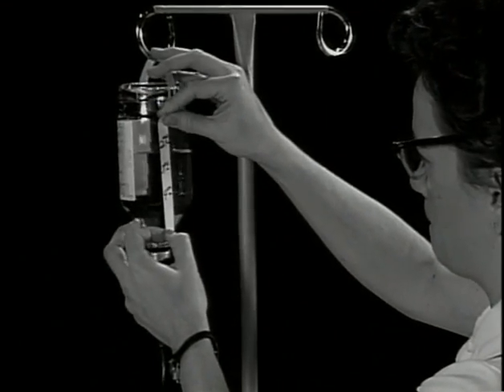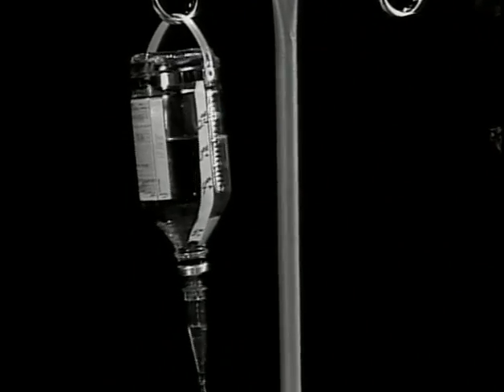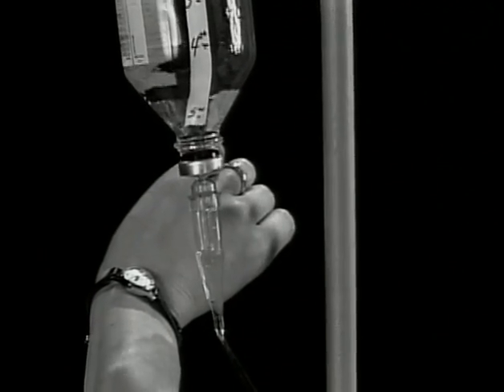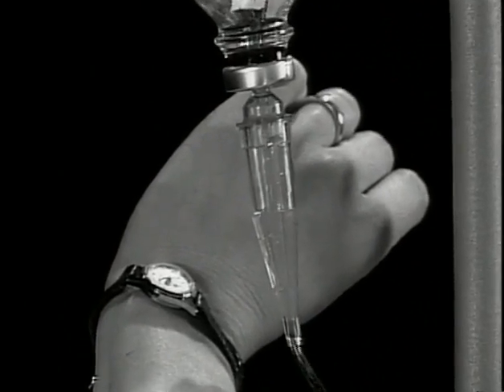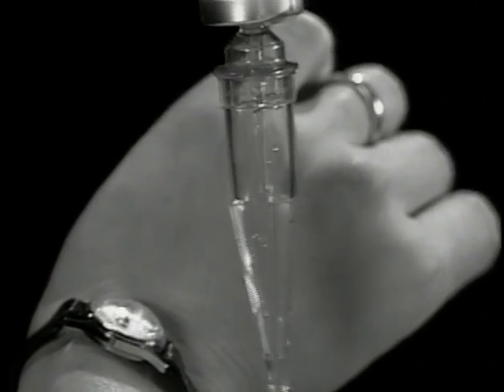The nurse would prepare the infusion in a glass IV bottle. She would calculate the number of milliliters needed per hour to get the rate of infusion as ordered by the physician. Then, she would mark a strip of tape indicating how much solution should be gone by a certain time, and place it on the bottle to monitor the infusion and be sure it was on schedule. Finally, the nurse would calculate the number of drips per minute needed to maintain that schedule, and set the infusion by using a roller clamp on the tubing.